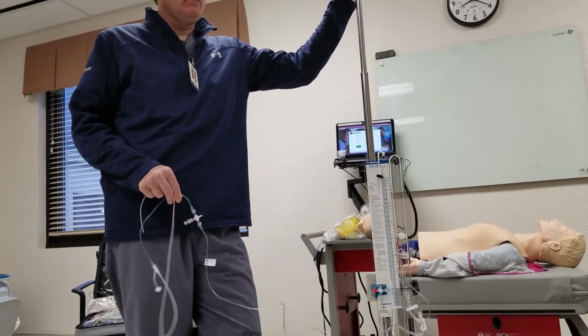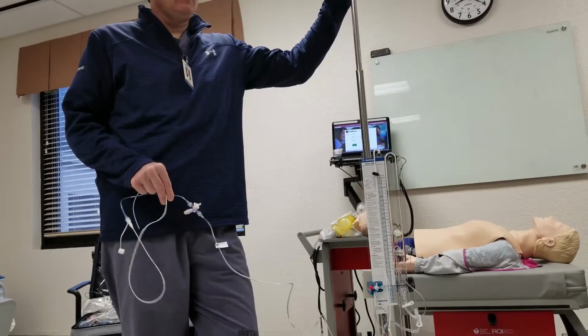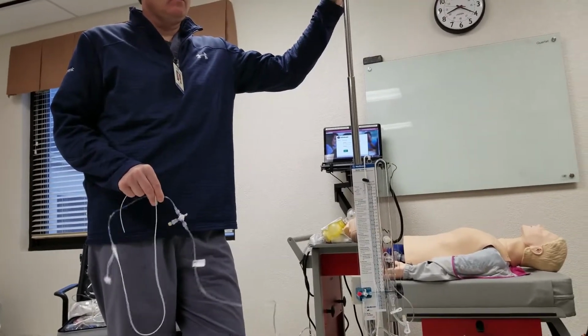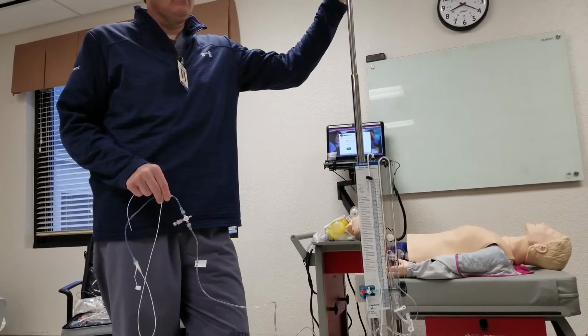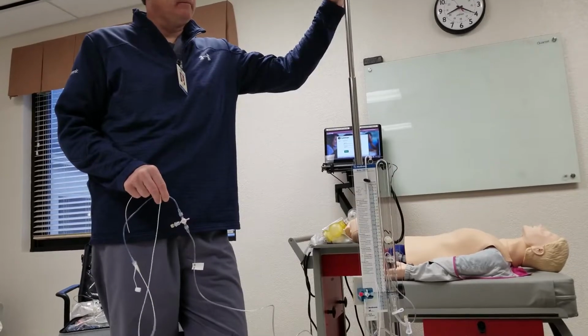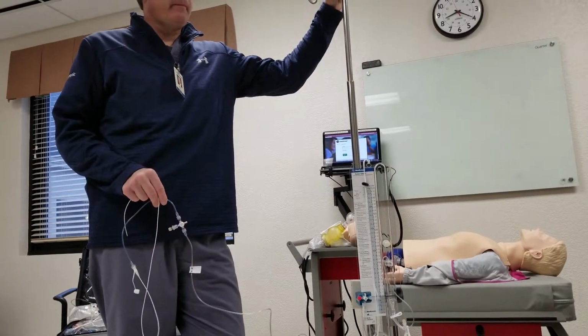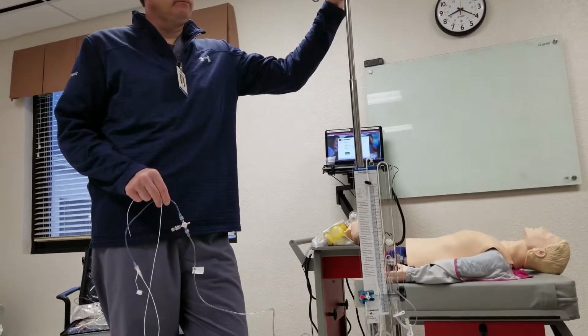So when Pat had talked to him, because Pat graciously came upstairs with that patient, he gave him the options, and Dr. Pelosa chose pressure for that particular patient. Ideally, what Kara and Krista and Kendra and I talked about yesterday is that we would prefer the patients to be volume so that you're closing the stopcocks before you're leaving the room.